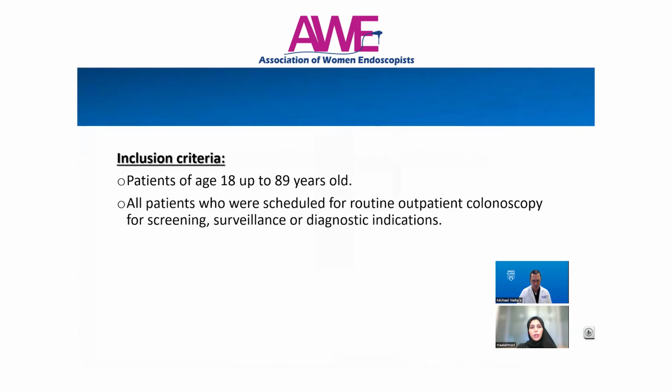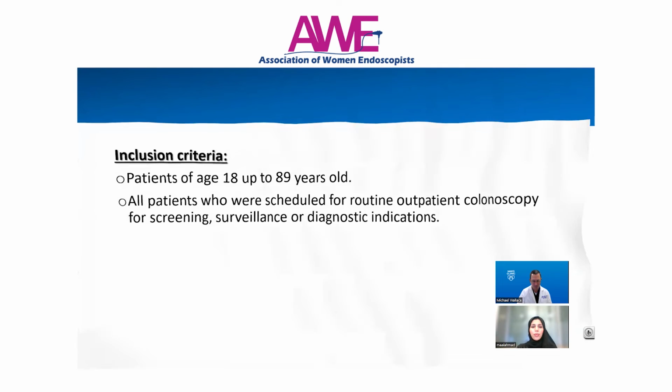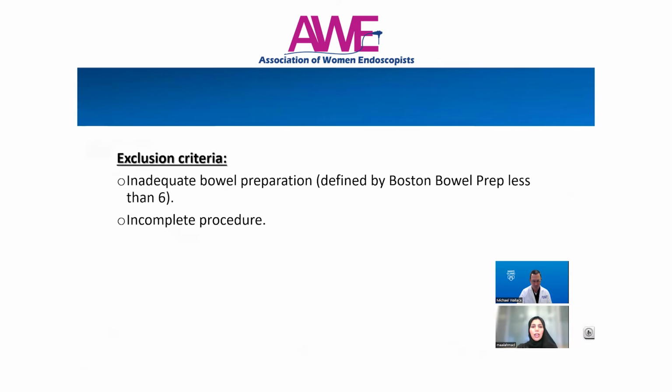So our inclusion criteria were patients of age 18 up to 89 years old, all patients who were scheduled for routine outpatient colonoscopy for screening, surveillance, or diagnostic indication. Our exclusion criteria were inadequate bowel preparation defined by Boston Bowel Prep less than 6 and incomplete procedure.